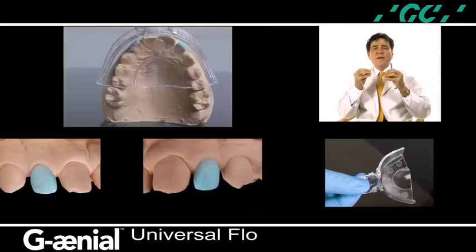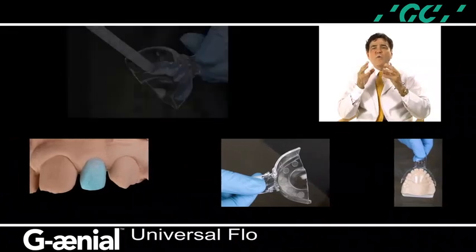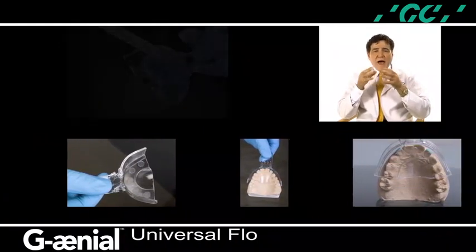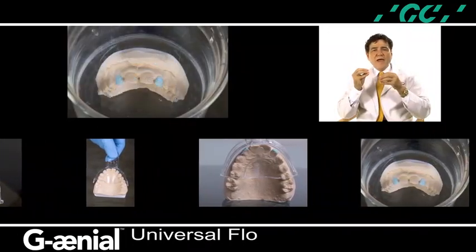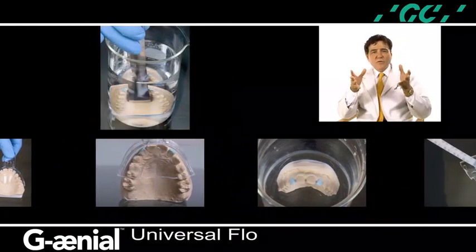A non-perforated clear plastic tray is sized to the diagnostic model. A uniform thickness of the impression material in the tray provides dimensional accuracy and stability. I place the diagnostic model into a beaker of water for 5 minutes prior to making the impression, and soaking the stone model facilitates its removal from the impression.